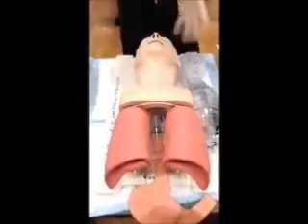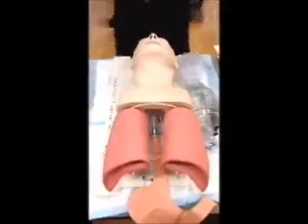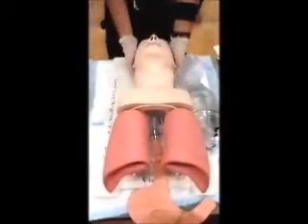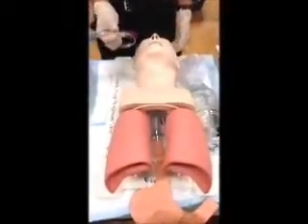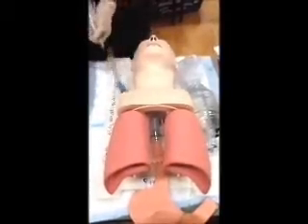Treatment is using BSI and aseptic technique. Patient is being oxygenated via nasal cannula at high flow. Patient height is 175 centimeters, which indicates the number 4 red-sized airway. Cuffs are inflated to 60 milliliters and examined for leaks or tears.